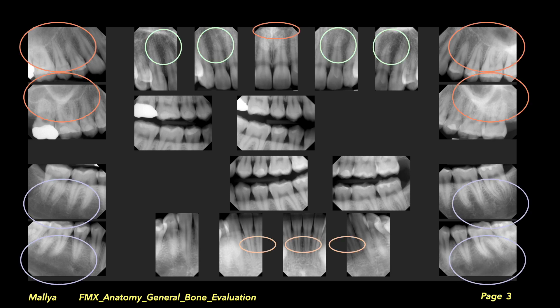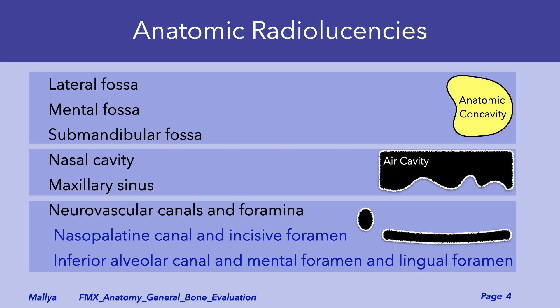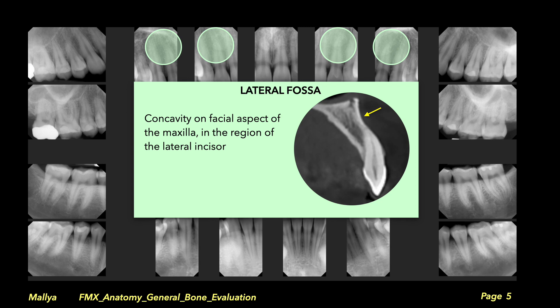At first glance you will note that there are certain areas within these images that appear relatively radiolucent. These areas are anatomic radiolucencies and can be considered in three broad groups: bone concavities, air cavities, and neurovascular bundles or canals. Now let's review those anatomic radiolucencies in more detail.